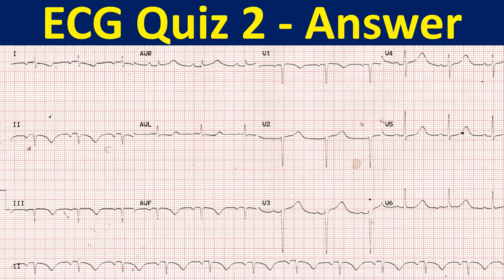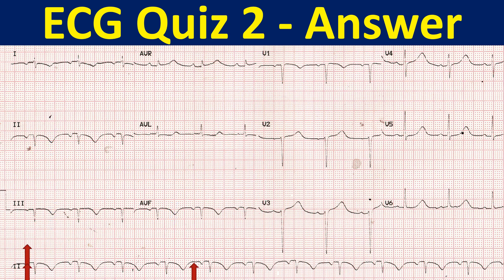At one look, the inferior leads make you think of an evolved inferior wall myocardial infarction because of QS complexes and T wave inversions. But the clue is the inverted P waves in the inferior leads. Uniform negativity of QRS complex and T waves along with P waves makes one suspect a misplaced left leg electrode.